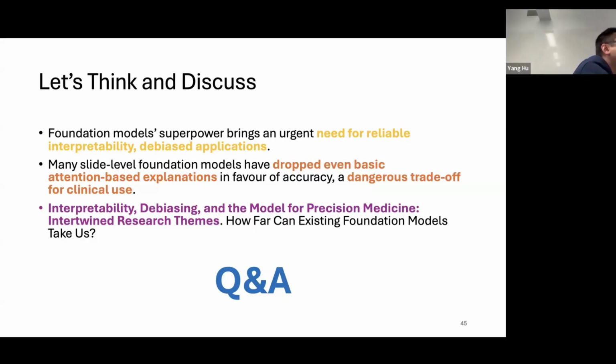I suppose my first thought was on the slide where you were combining lots of different foundation models. I think the slide you showed afterwards did that. So you do some sort of pooling per foundation model feature embedding, then you stack them and put them through your attention model.